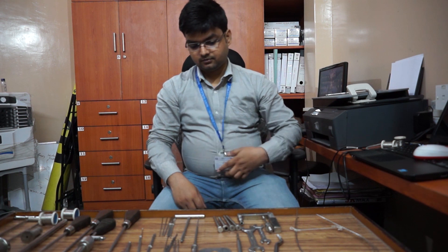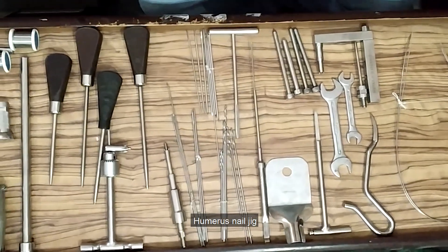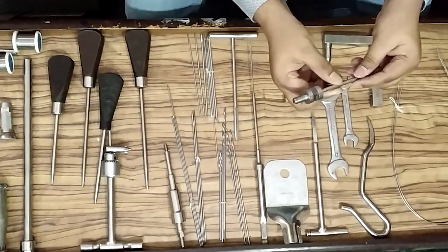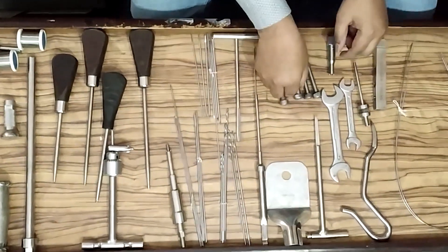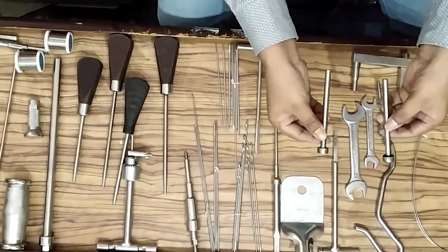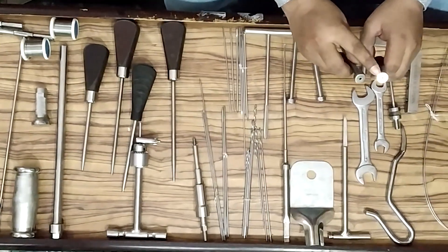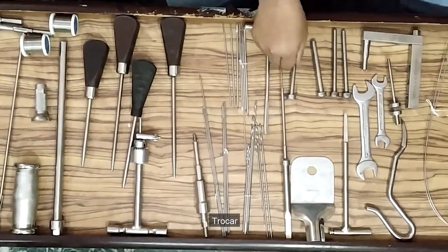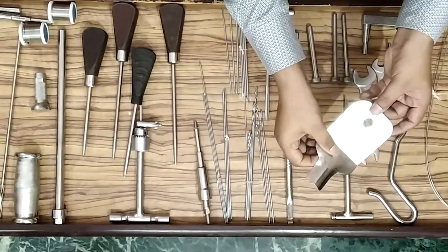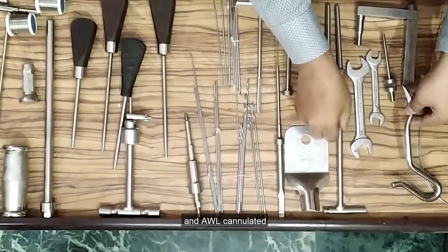Humerus nail instruments: Humerus nail jig, conical bolt, protection sleeve, drill sleeve in 3.2mm and 2.7mm, tracker, tissue protector — all solid and all cannulated versions.